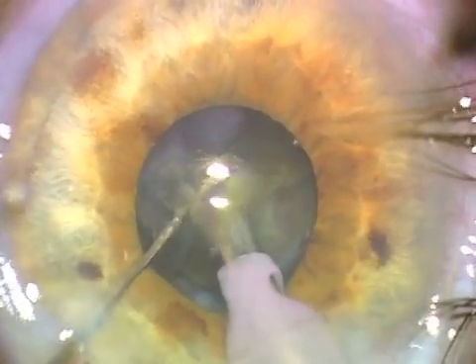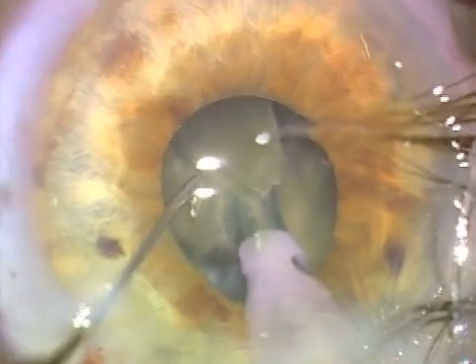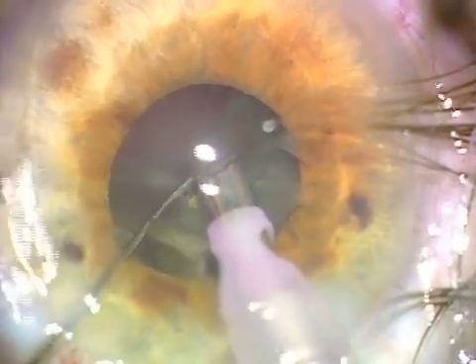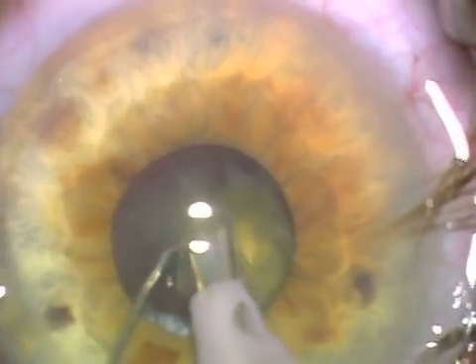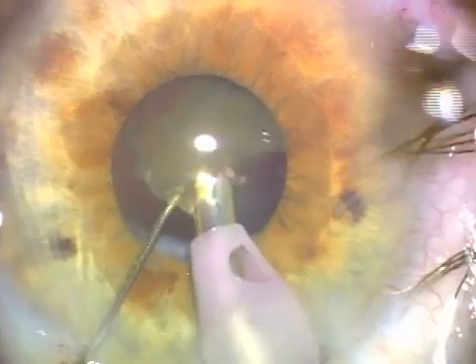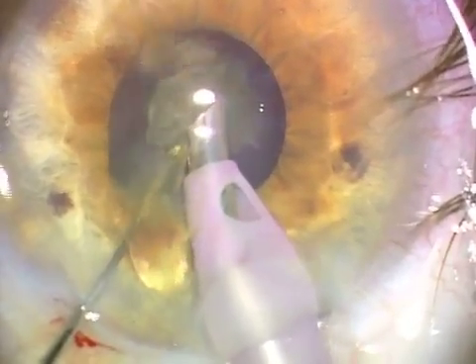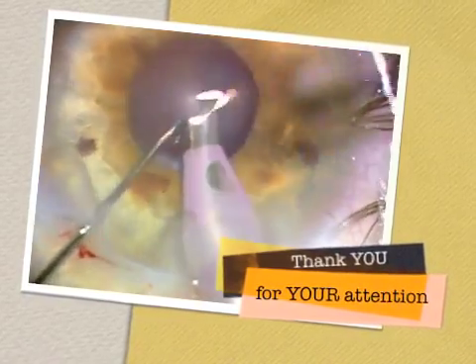Now we're getting down to the last segment — we have to start thinking more about the posterior capsule as we get to the last segment. Notice my second instrument is always under and a little ahead of the tip as I'm phacoing, to make sure that if the capsule does come up with surge, my second instrument is protecting it. If the second instrument is not moving, it won't rupture the capsule even though the capsule may come up against it. So both instruments are in the center of the eye, with the second instrument underneath. Now as I'm having to come up a little more, you can see that more of the viscoelastic has been removed.